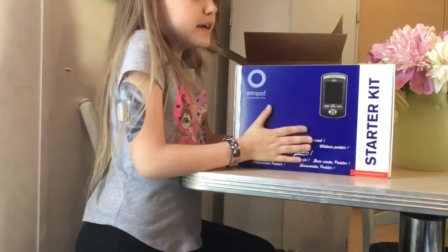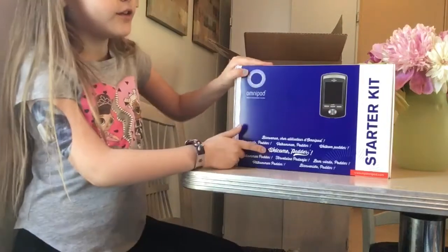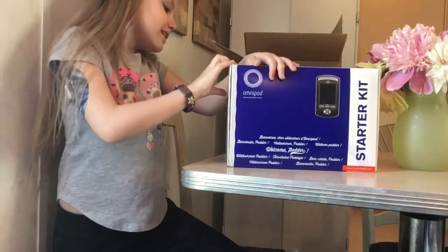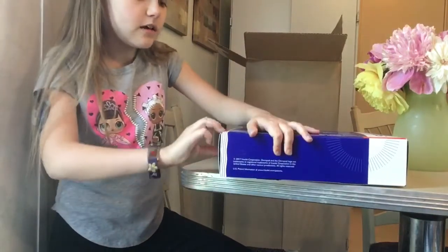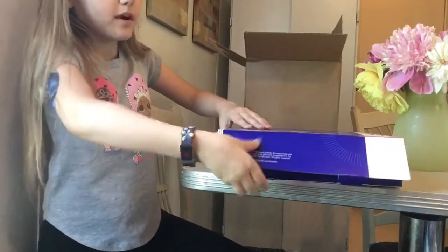So this is the PDM starter kit, and it says welcome — I think. Now I'm going to see what's inside of it. I mean I kind of know what's inside, but my mom was going to remind me about all this stuff and I was like, I want to be surprised.